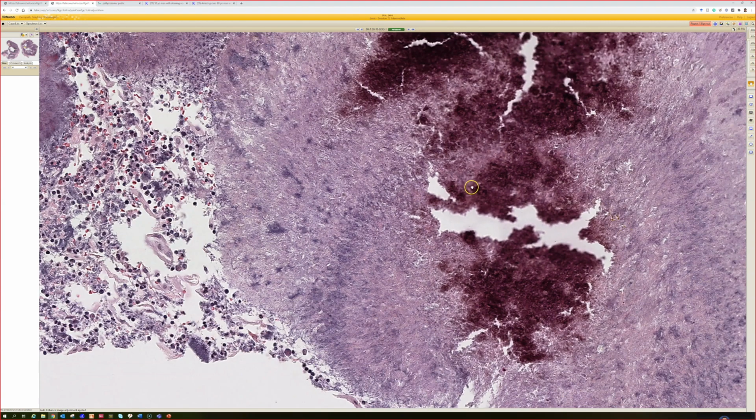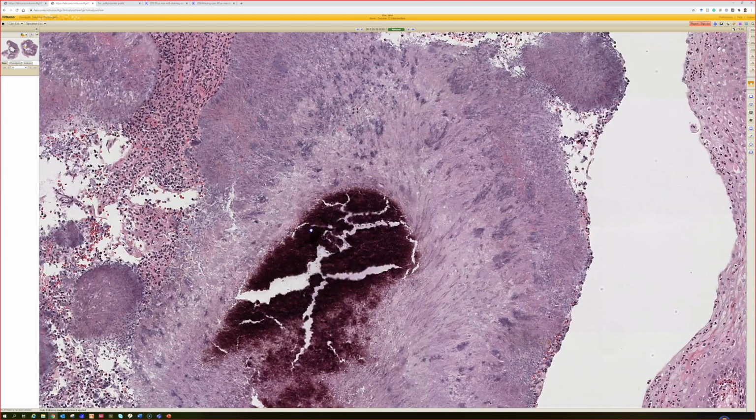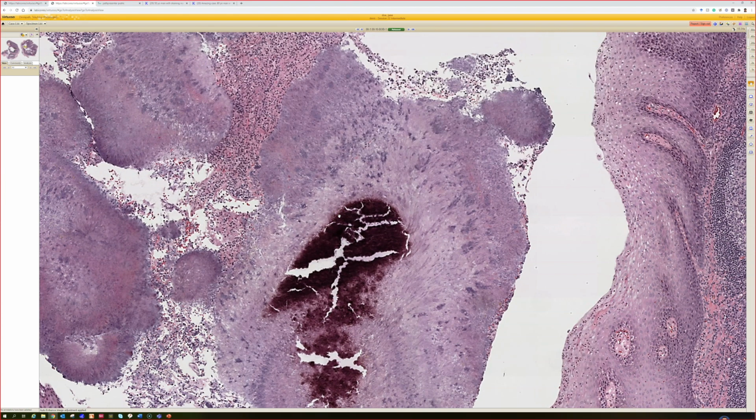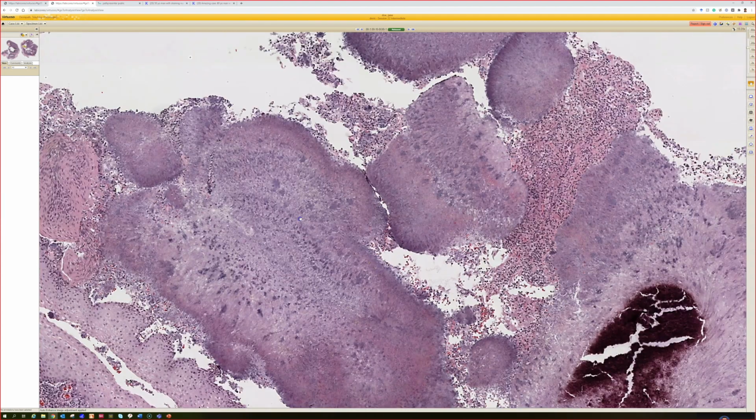What other things can make structures kind of like this? You're right. This is basically what the sulfur granule is in a draining sinus from actinomycotic mycetoma. In these cases, this is basically a variant of normal. This is actinomyces growing in the tonsillar crypts. Some people call these tonsil stones, I think is a term that gets used for them. But basically, this is a relatively common finding in tonsil, and in my way of thinking, it's not really representative of a serious disease process.